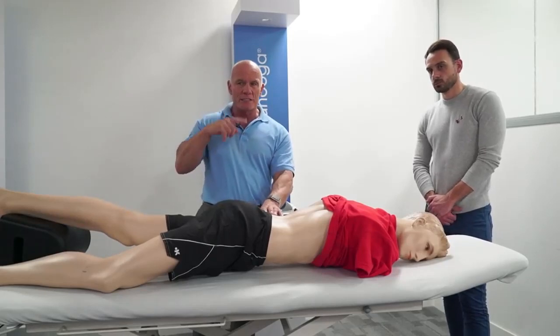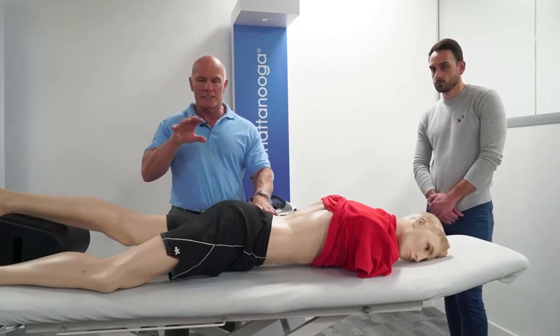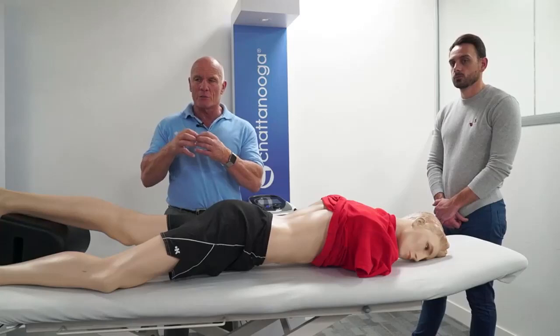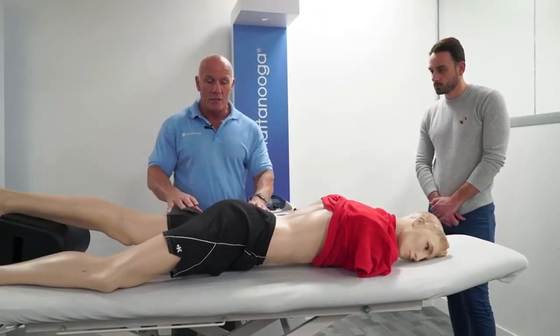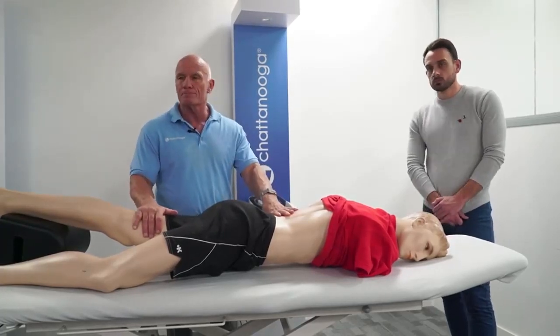An external force can facilitate this, and there have been various studies, including one published in 2017 by Sang, that showed us that ultrasound is one of the things that can trigger the differentiation of stem cells. For me, this is the most exciting part of ultrasound therapy, and why we're launching a whole educational campaign called the Rebirth of Ultrasound. Okay, moving on.